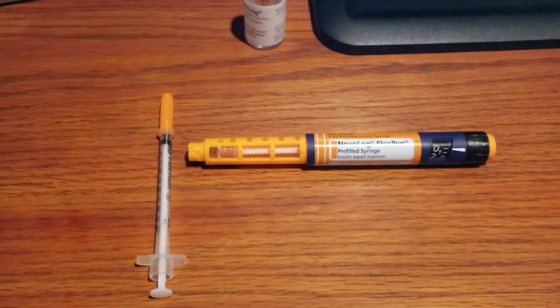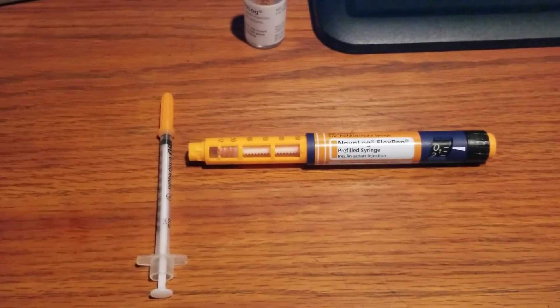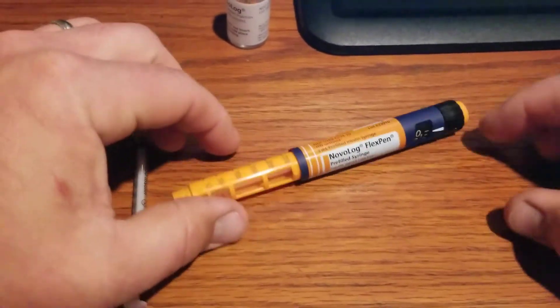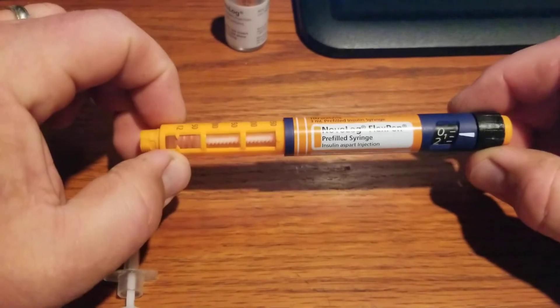I'm going to show you how to draw insulin — the last bit of insulin — out of an insulin syringe that says it's empty.